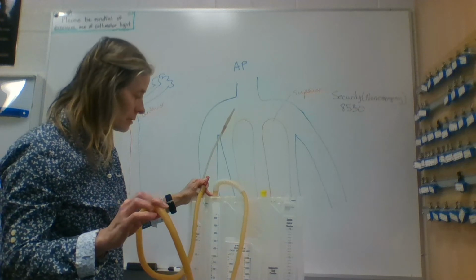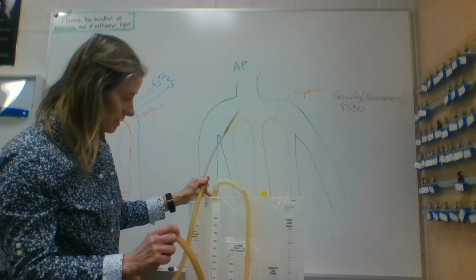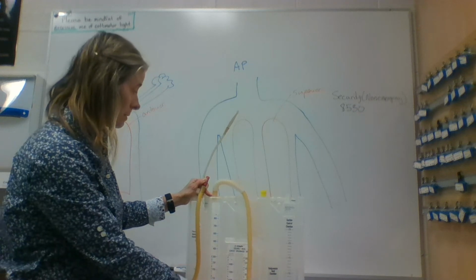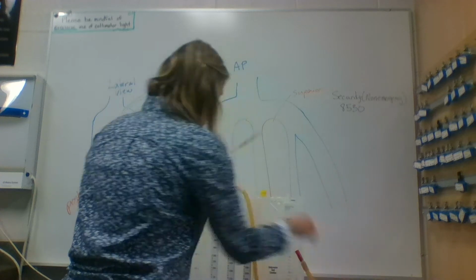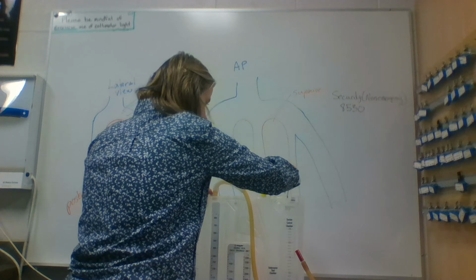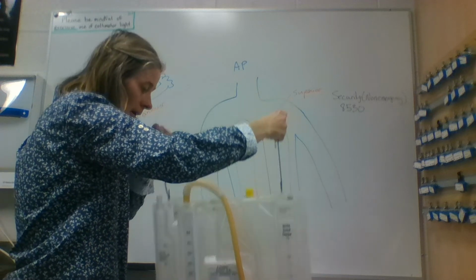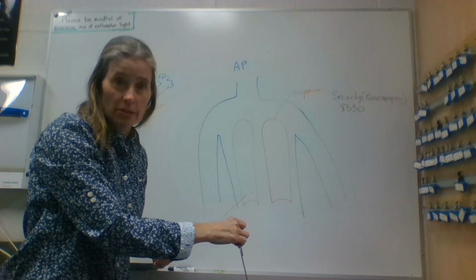There's quite a bit of length on this tubing. But this is where, as technologists, we have to be careful when we're handling these chest tubes, because we don't want to dislodge or pull or accidentally yank on any of this tubing. These drainage units will come down with these hooks. These units will hang below the area of the insertion site.